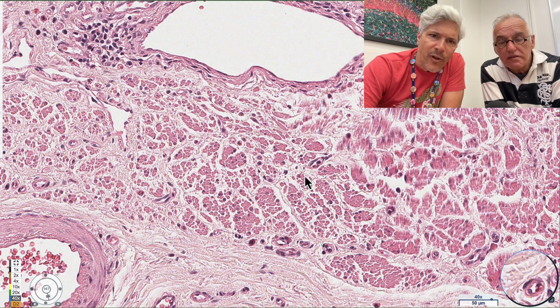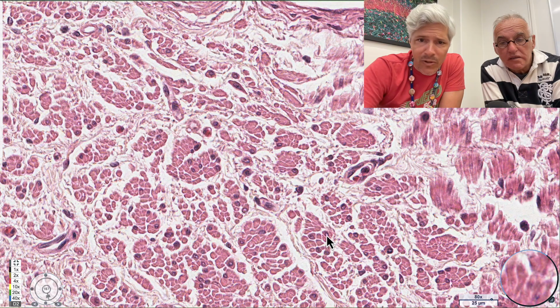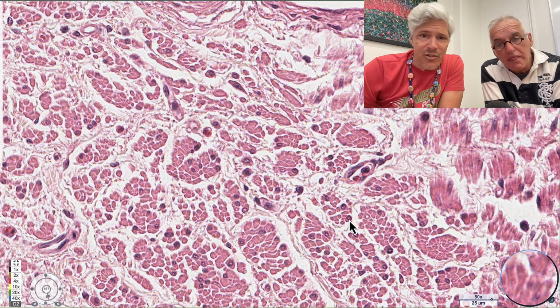Just looking at them in cross-section, I see lots of very small profiles, and some where we happen to catch a nucleus. Some where the nucleus tends to dominate the whole small profile. The nuclei seem to be relatively well centered. They're certainly not shoved out peripherally.